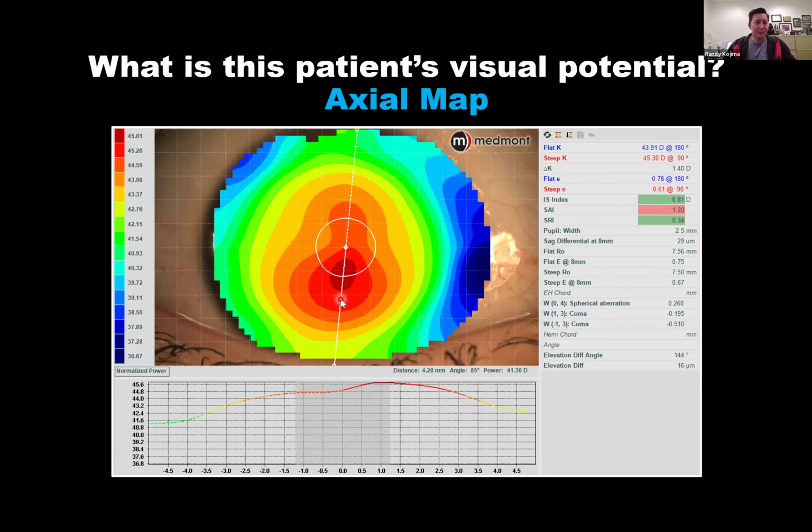It sounds like such a simple thing, but it really is such an important thing in that we can look at these topographies and determine, is this a patient that can probably be fit with conventional glasses and soft lenses, or do we need rigid lens optics? We can get a very quick analysis or screening of the patient's potential for supervision, essentially.